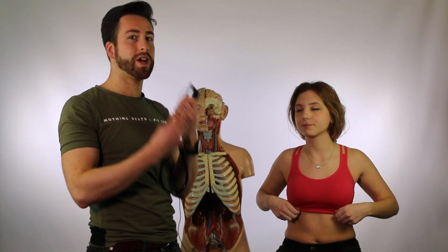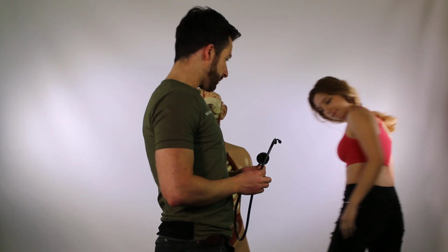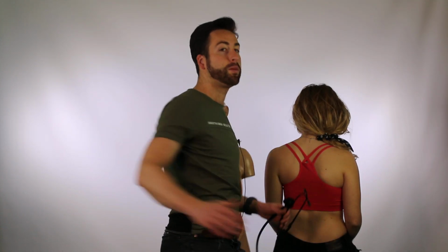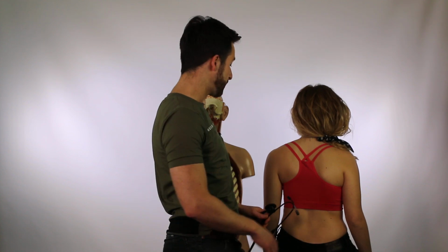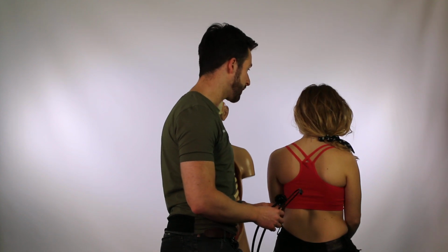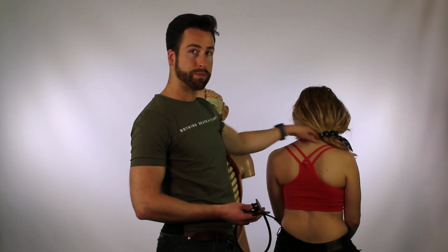Okay, so we're going to ask our patient to move around so I can show the posterior auscultation. To eliminate the scapula being in the way, we're going to ask the patient to put her hands on her knees, and a little bit forward. Yeah, there we go. So we're going to start again with the apex on both sides.